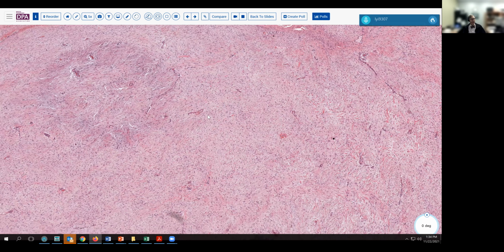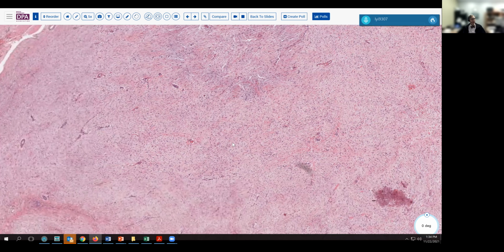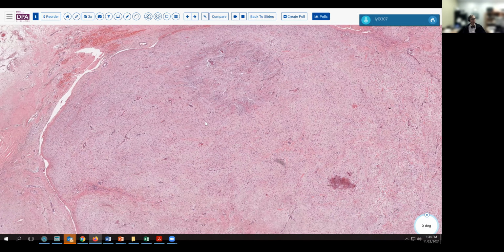Now, this is an important lesion to identify on biopsy because this is no longer, in most cases, considered a surgical disease, as it can be managed quite adequately conservatively and using potentially targeted therapy for some of the specific molecular drivers in this tumor. So the thing that helps us to define and differentiate this low-grade spindle cell lesion from other tumors, such as low-grade fibromyxoid sarcoma or other spindle cell tumors like solitary fibrous tumor and so forth, is the presence of a CTNNB1 mutation, or in other words, a beta-catenin expressing tumor.